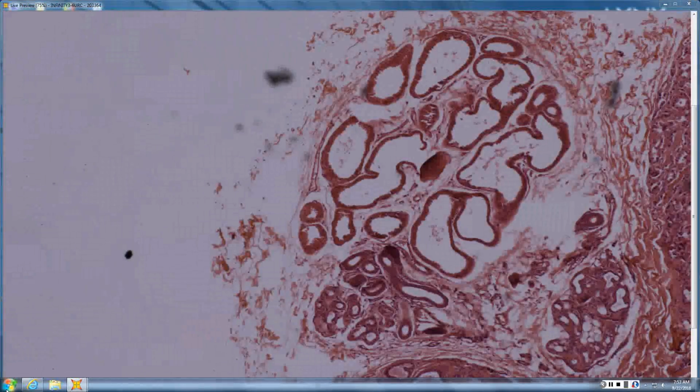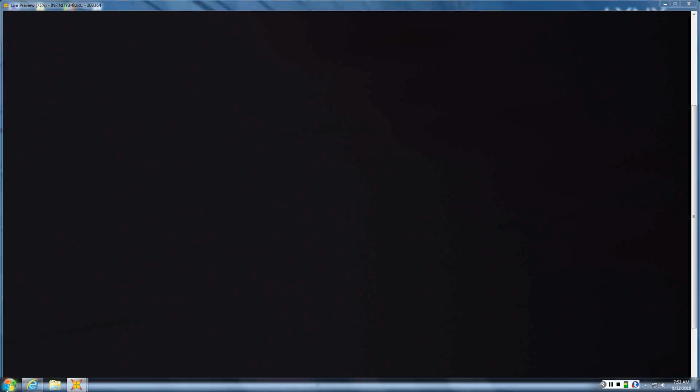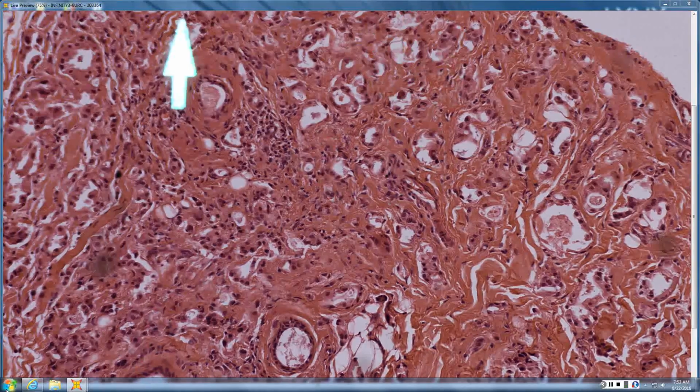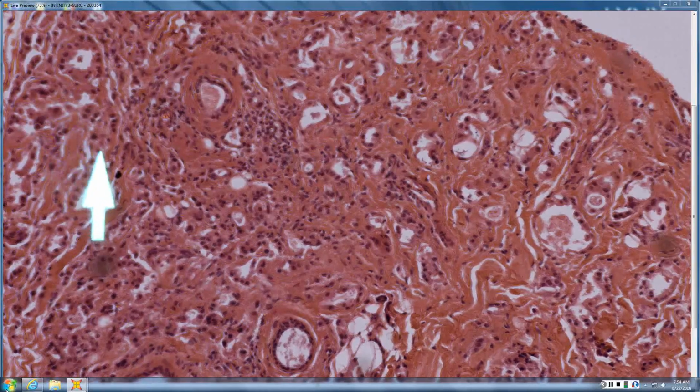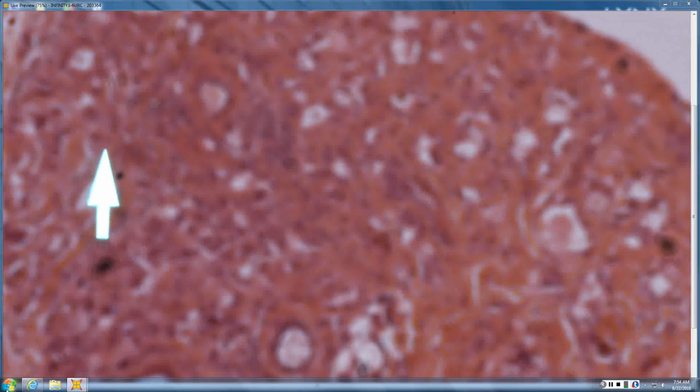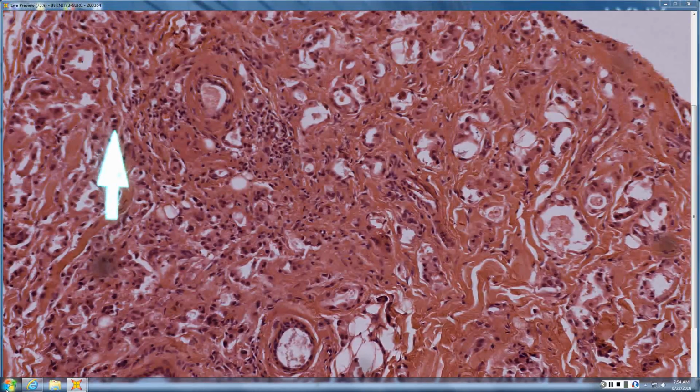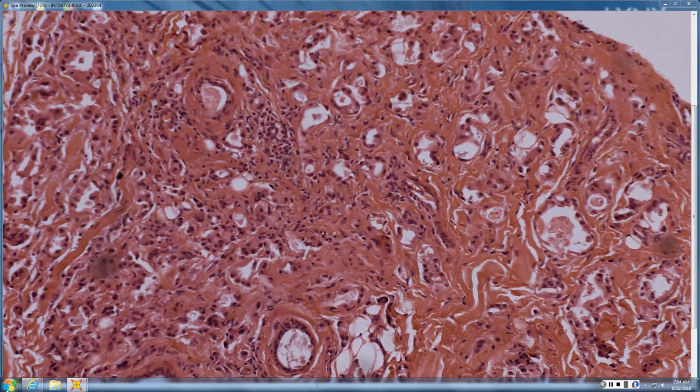This reminds you of the tubular apocrine adenoma. Yeah, it looks kind of like a tubular apocrine adenoma. We're actually, though, in the axilla, and so those are just normal apocrine glands. And then immediately adjacent to that, what's happened? So you have normal apocrine glands, and then growing out of them, you have these highly abnormal apocrine glands, right? They have a high nuclear cytoplasmic ratio in areas. Let's try to get that in focus. In areas you have nuclear molding, just like you get in breast cancer. So what do you think is going on here?